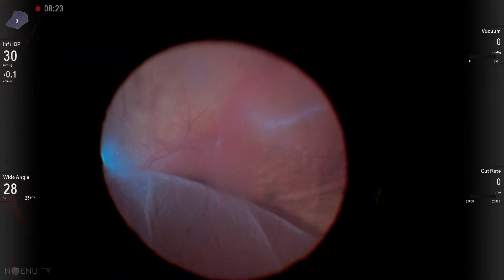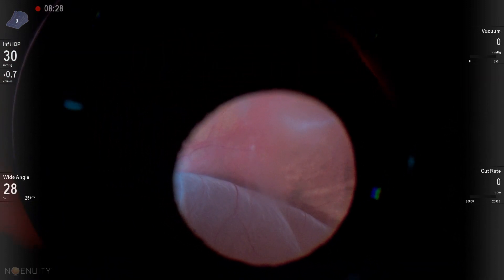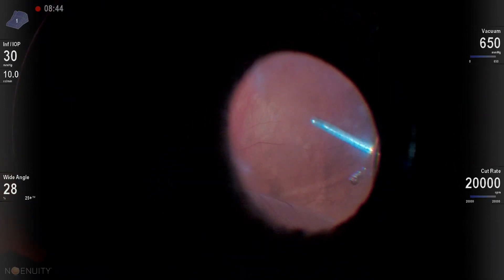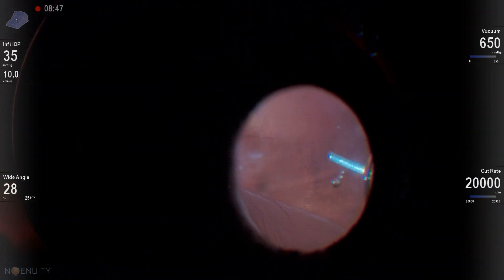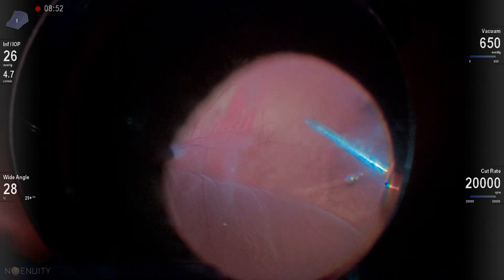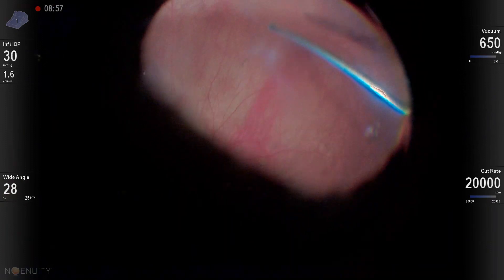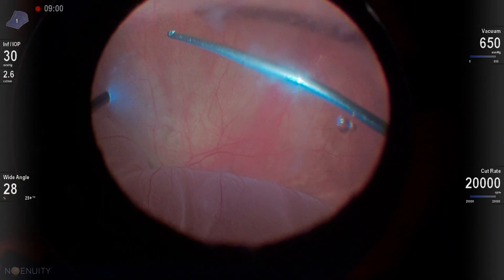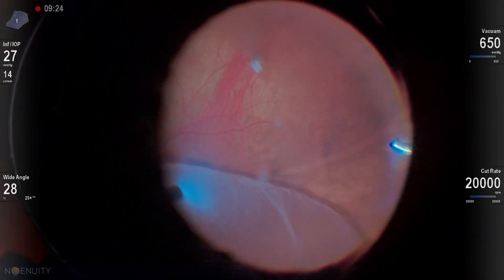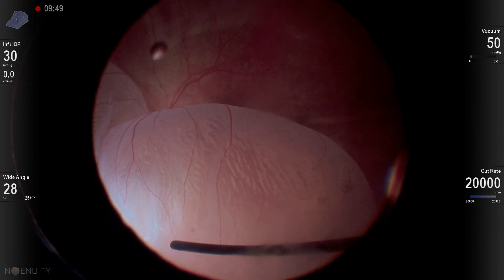I'm using my cannula and trocar to help twist the eye so I can get the cannula and trocar in the proper position. A real key when starting out: if you have a bullous mobile retinal detachment like we have here superiorly, always start your vitrectomy over that attached retina away from your bullous detachment. You can remove at least half of the vitreous that way without the risk of causing a retinal break, tear, or incarcerating the retina in your cutter.